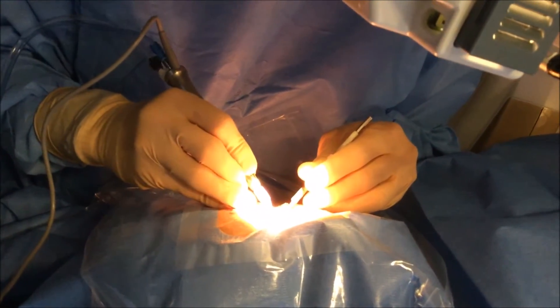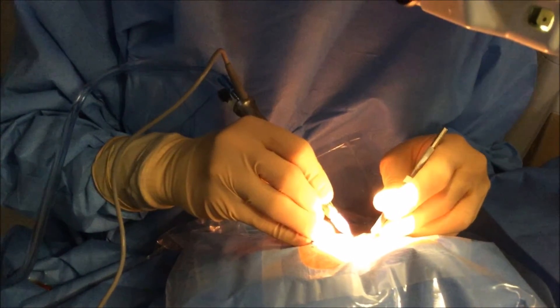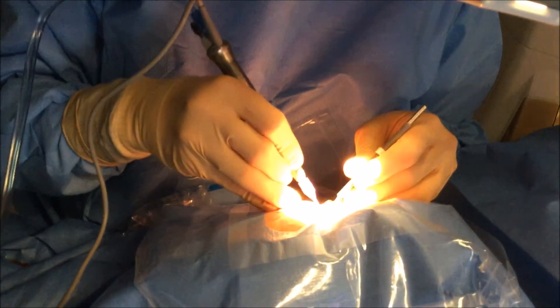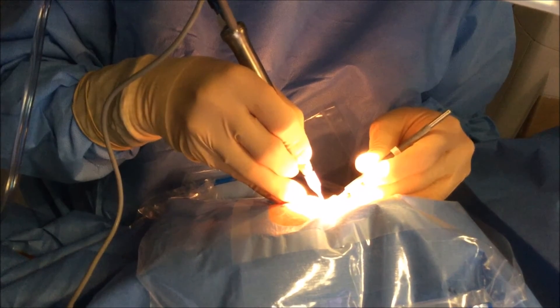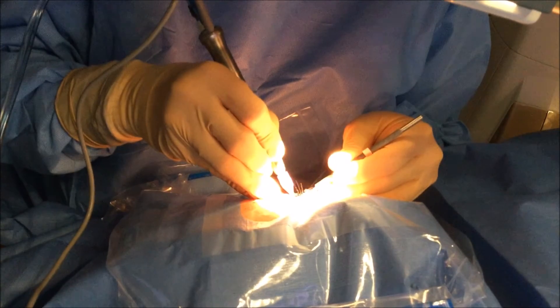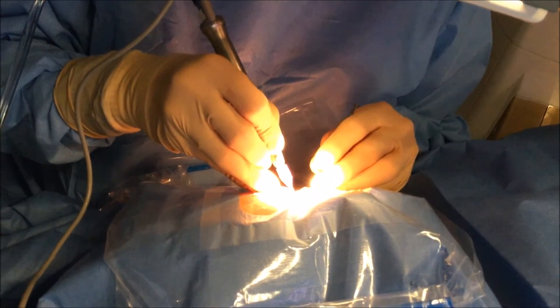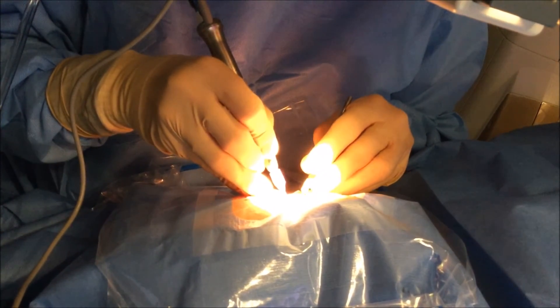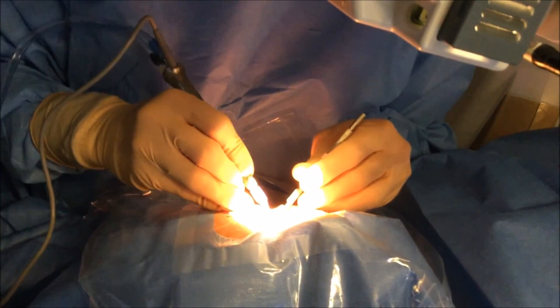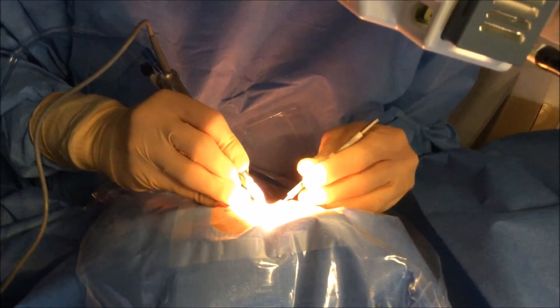It happens very quickly, so let me show this again in slow motion. The chopper is being placed out under the equator right now — you can see I'm sliding with my left hand. Now I'm placing my facotip more vertical to perform the double chop maneuver. I'm using my pinky to support myself against the patient's face in order to stabilize my fingers, and the chop is performed. Now the cross chop is being performed — the chopper is slid out under the equator and then the cross chop maneuver is performed. Now the facotip is placed in the more neutral position and faco is initiated.